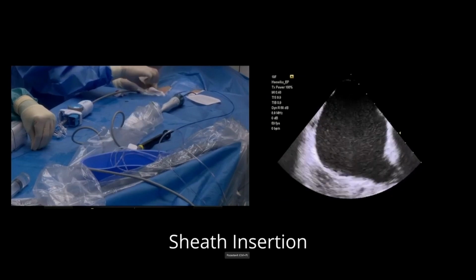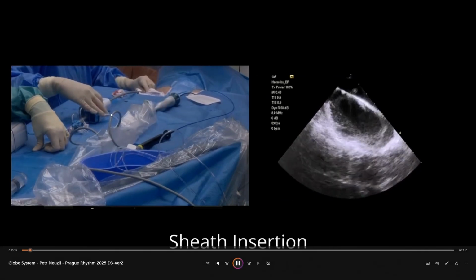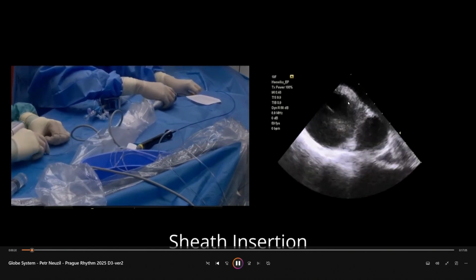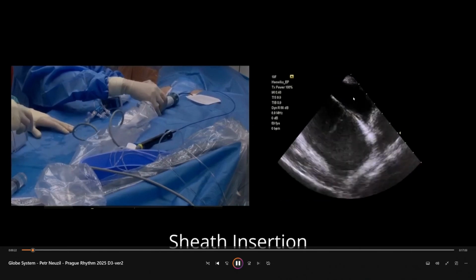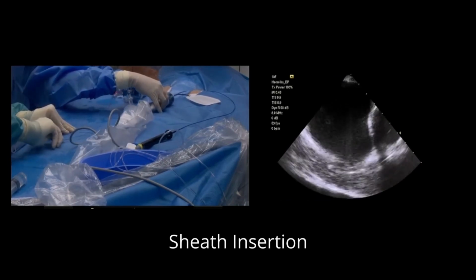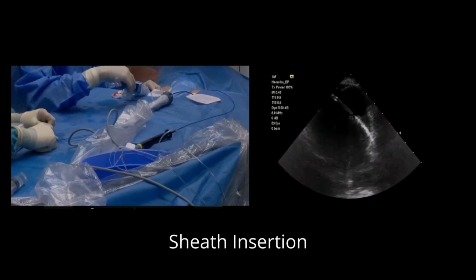So we are inserting just the introducer with the dilator into the left atrium, and you can see that we have a wire in the left atrium. We are using a super stiff, extra stiff wire, not like the SL wire or the usual transseptal wires, but really extra stiff wires.